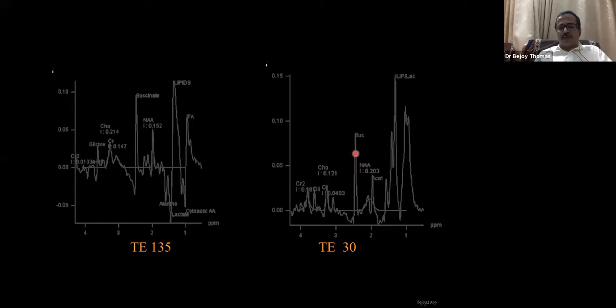So the acetate to succinate ratio can also differentiate between a pyogenic abscess and a parasitic abscess. When you see all these things, we know that it is an anaerobic abscess. Because of the anaerobic metabolism, succinate and acetate get accumulated, because of conversion to oxaloacetate and malate, and then in the mitochondria they get separated into succinate and acetate, and they keep accumulating.